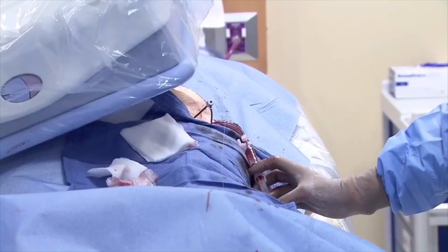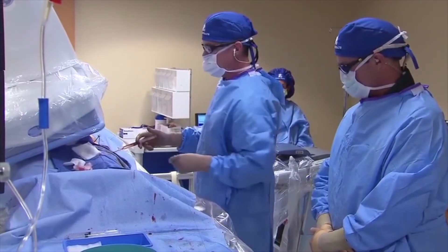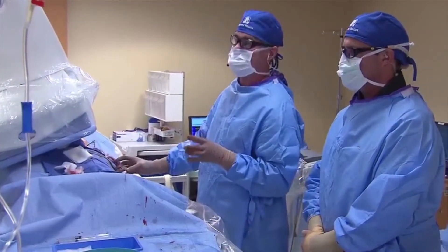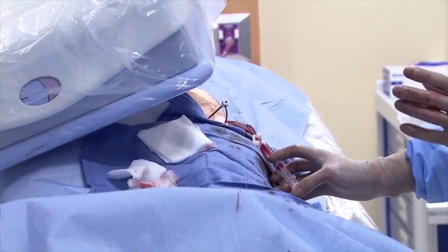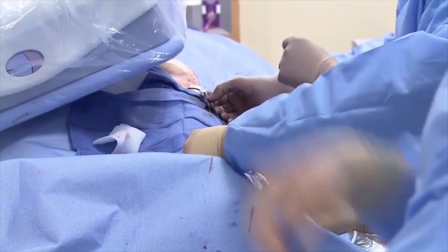We're going to make some cuts through this proximal area and then go down to get that more severe lesion just above the knee joint. We'll do some magnification views to get a nice mask and then proceed with the atherectomy. Her contralateral leg had very severe disease — a complete occlusion of the vessel, not just areas of stenosis or narrowing, but a total occlusion over a fairly long length, which can take quite a while to resolve.